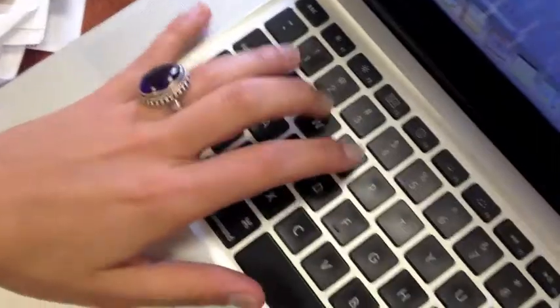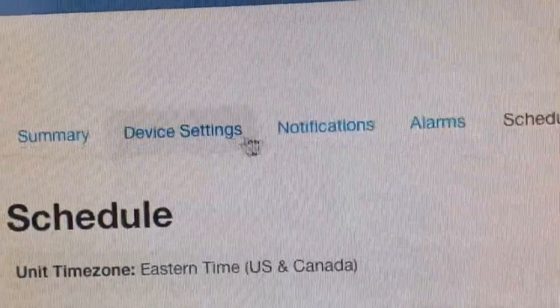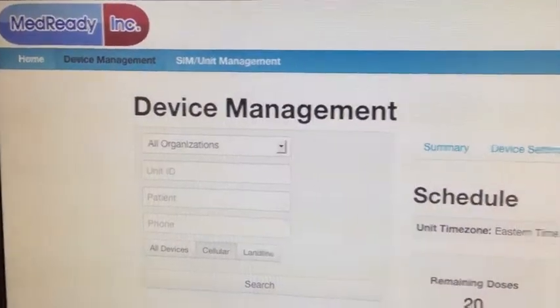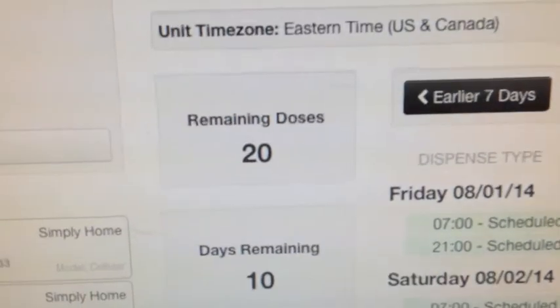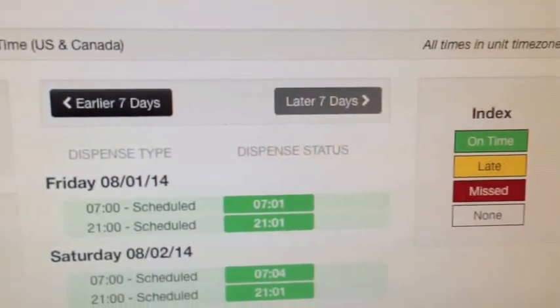Just like with many of our other Simply Home systems, the cellular medication dispenser comes with a password-protected website, which we provide you access to, that allows you to see information about your system. Much like the landline version, you can see compliance history for the doses, but it also gives you a few other features. One, it allows you to track the remaining doses that you have in the system before your next refill is needed.